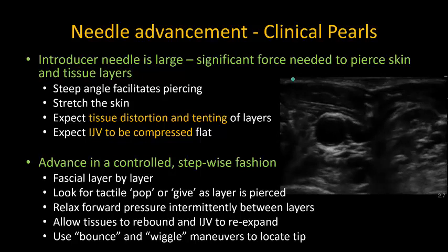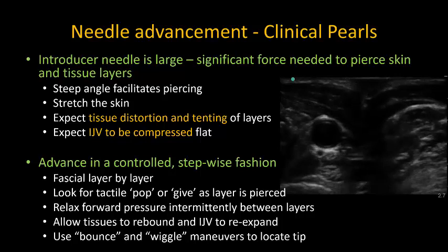Gently bouncing up and down with the needle will indent the next fascial layer, and thus you'll be able to see precisely where the tip is in relation to the different layers and structures.